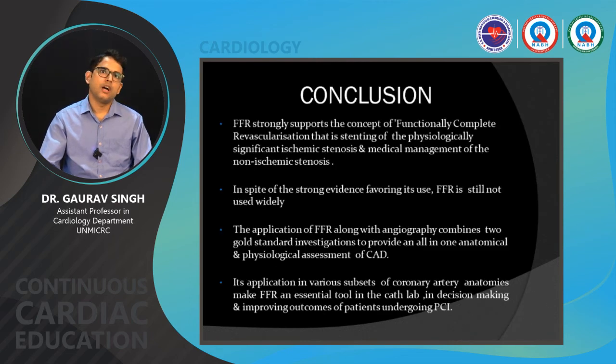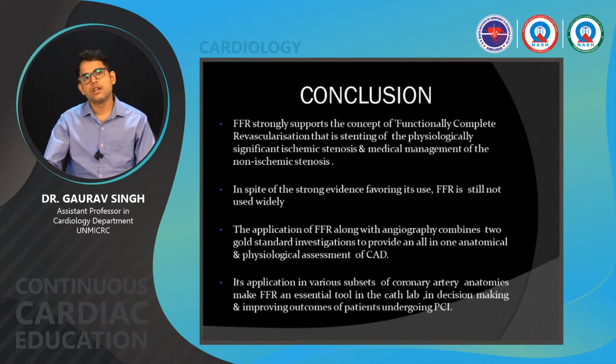So in conclusion, FFR strongly supports the concept of functionally complete revascularization, that is, stenting of the physiologically significant ischemic stenosis and medical management of the non-ischemic stenosis. In spite of strong evidence favoring its use, FFR is still not used widely. The application of FFR along with angiography combines two gold standard investigations to provide an all-in-one anatomical and physiological assessment of coronary artery disease. Its application in various subsets of coronary artery anatomies makes FFR an essential tool in the cath lab in decision making and improving outcomes of patients undergoing PCI.